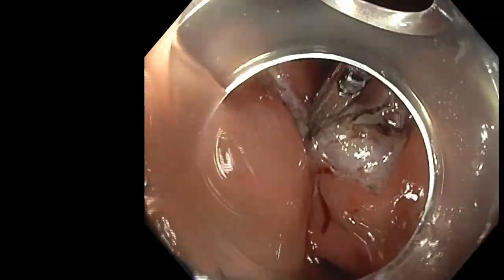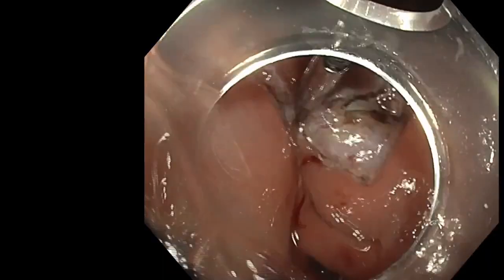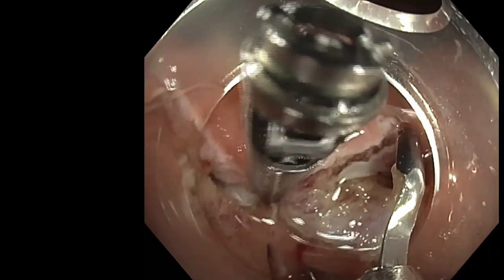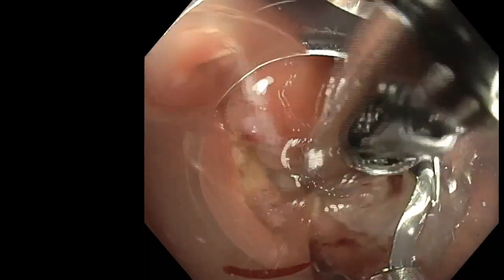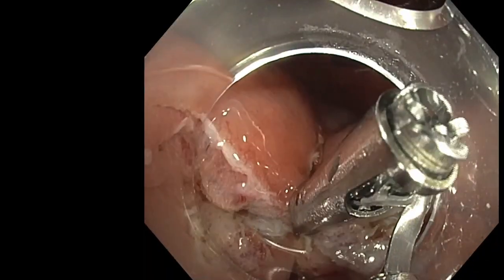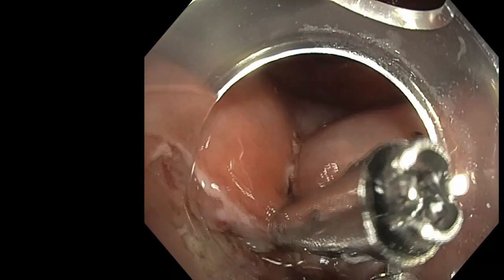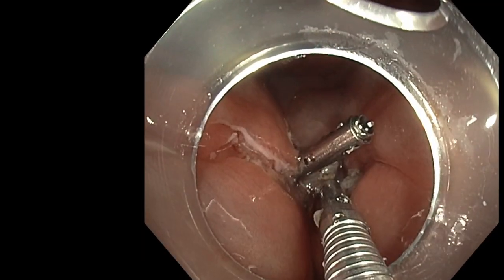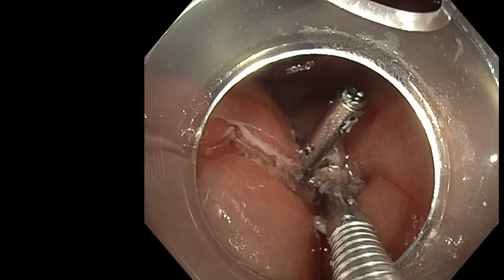It's relatively long because we use reloadable clips in order to reduce the waste. So it takes a little time to reload and fix it compared to single-use ones, because single-use clips are 90 grams of waste.